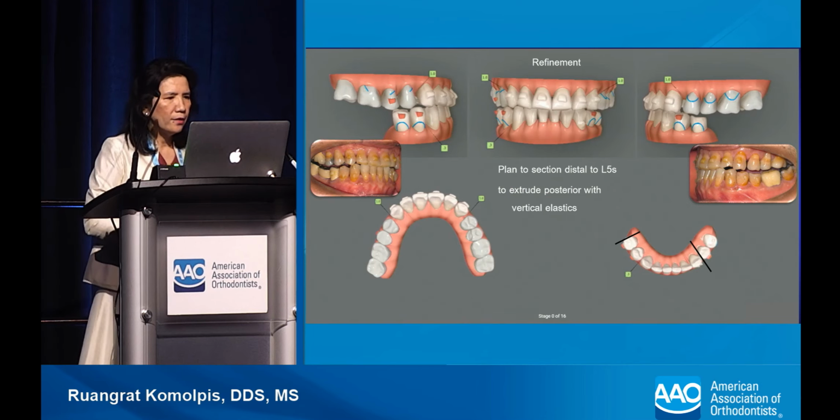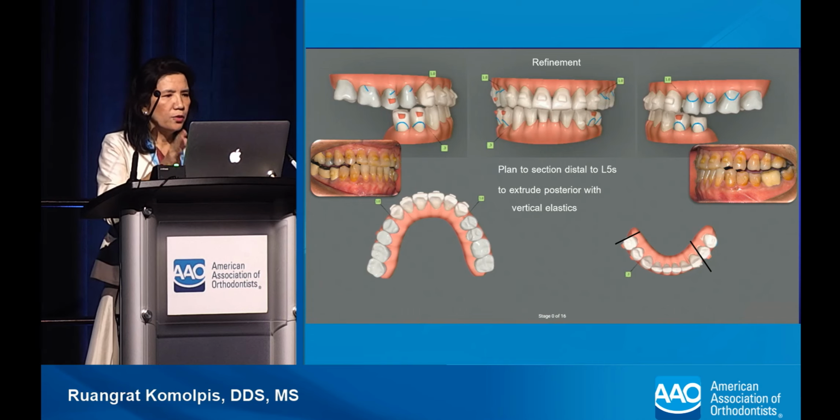I section the aligners in the lower arch, just distal to the lower 5s, to extrude the posterior teeth. And when I use it clinically, I actually cut distal to the lower left canine to get more extrusion of the premolars, and cut the distal surface of the lower right 5. When we want to section the aligner, we don't want to have the distal surface of the last tooth seen in the plan. Otherwise, this area will be covered with plastic, and you have to take the plastic out of the bag and cut the aligners.